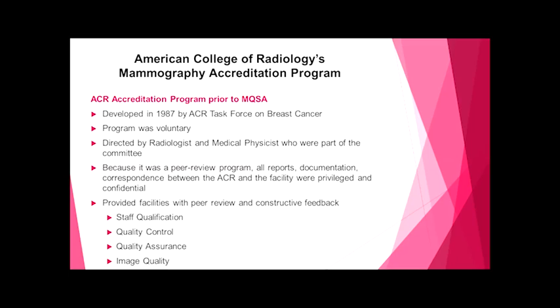ACR accreditation program prior to MQSA. Mammography accreditation is not new. In fact, it was developed in 1987 by an ACR task force on breast cancer. At the time, the ACR recognized the need to address an improvement in quality in mammography, and so they voluntarily developed this program.